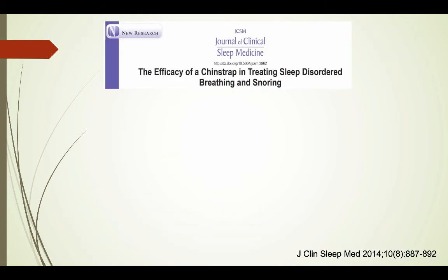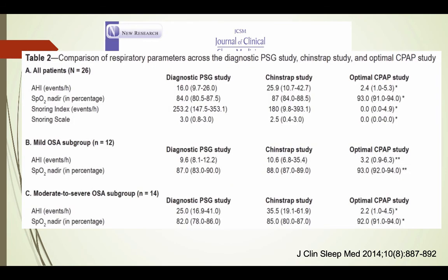Before I end my talk, I really want to share with you one study, because in 2007 a study came out saying if you snore, chin strap alone, no need to use CPAP, can cure your OSA and snoring. But I want to highlight that chin strap alone does not cure snoring, and you can see over here all patients on diagnostic PSG had AHI in the moderate range, whereas the chin strap study also had it in the moderate range.